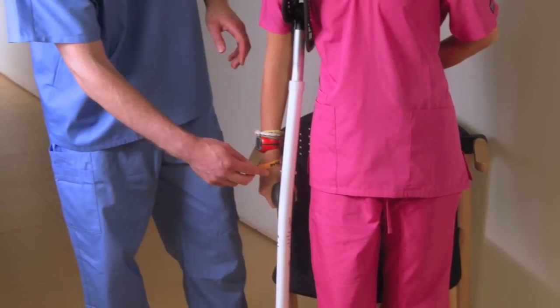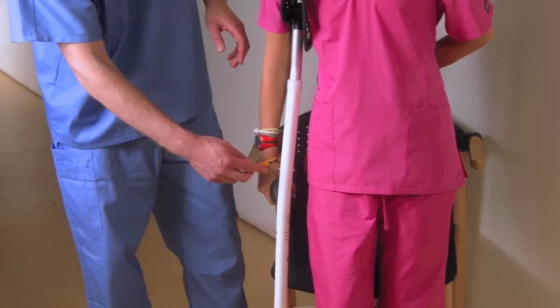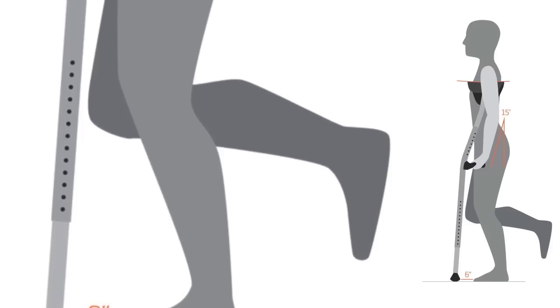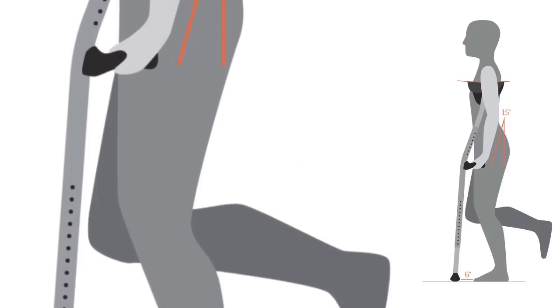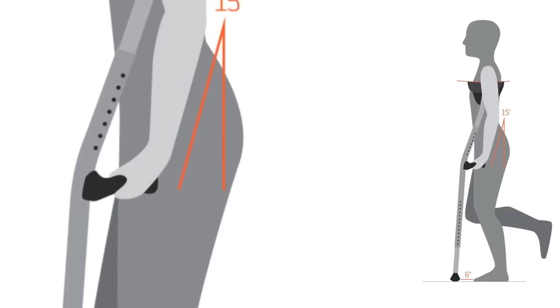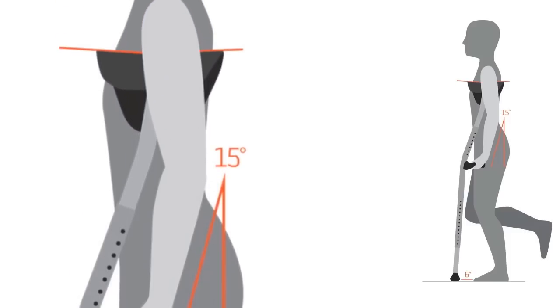To complete the process, simply move the adjustment buttons to the corresponding alignment holes on your MobiLex for the opposite hand. Please note the proper position of the user as shown: you should be comfortably upright in your stance, the MobiLex should be close to your body, your arm should be slightly bent, and the Ultra Saddle should be snug under your arm.